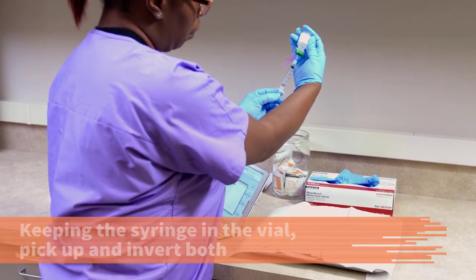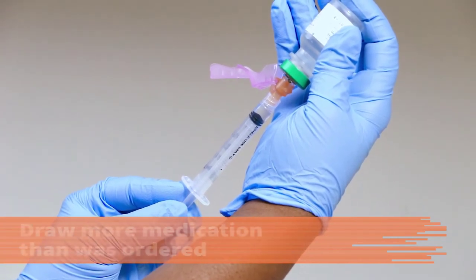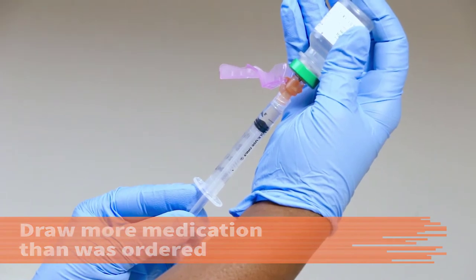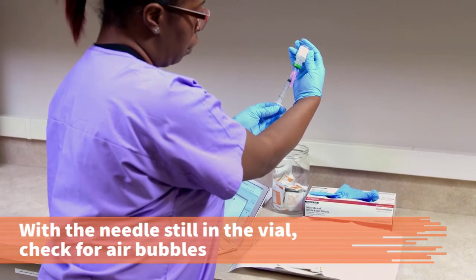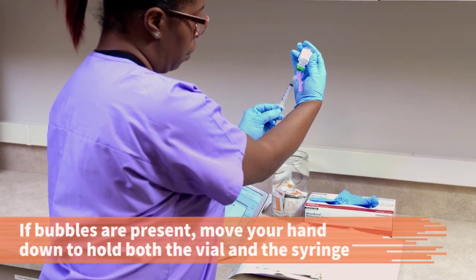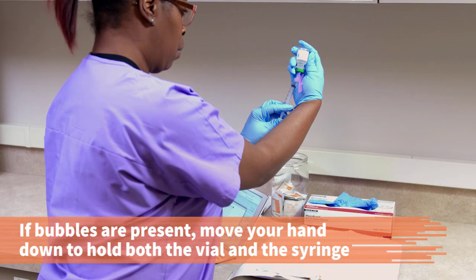Slowly pull back on the plunger with the unit at eye level and draw up more medication than ordered into the syringe unit. While the needle is still in the vial, check for air bubbles in the syringe. If air bubbles are present, move the fingers holding the vial down to grasp the vial and syringe as a single unit.